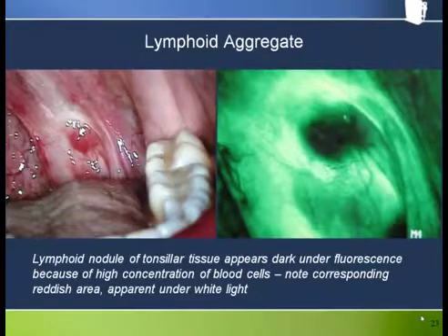In this case, the dramatic appearance under fluorescence does nothing more than help alert us to its presence, which in this particular case it did. But the presence of darkness corresponding to redness gives us no additional cause for concern above and beyond what the presentation under white light does in and of itself. If there were dark areas extending away from the lesion, not corresponding to the red nodule apparent under white light, this would give us greater cause for concern.